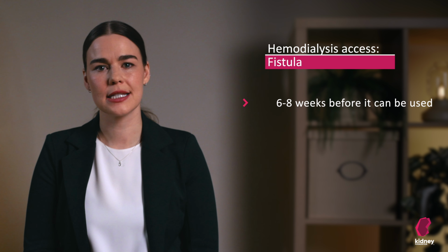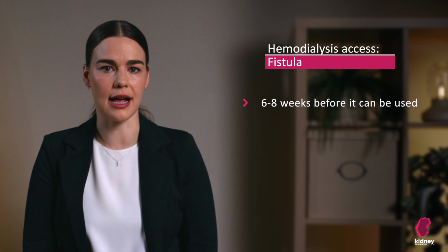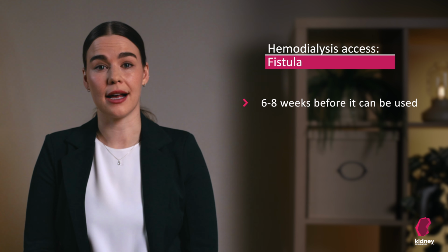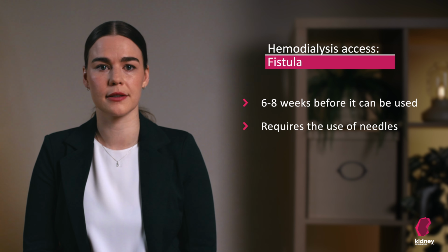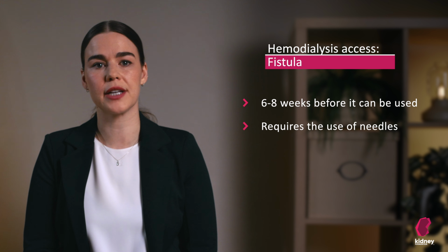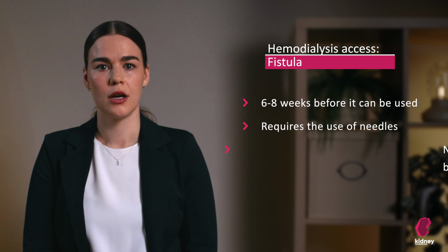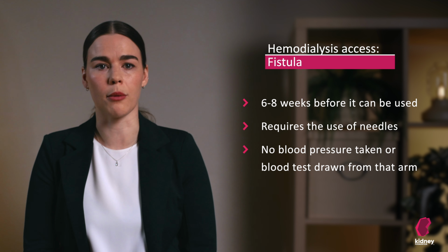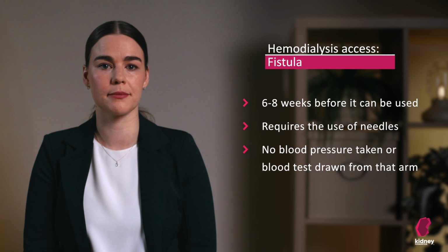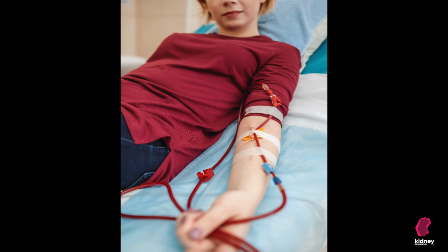You must wait 6 to 8 weeks after the fistula is created before it can be used for hemodialysis. At each dialysis session, a nurse will insert 2 needles in your arm to do the treatment. The needles will be removed at the end of the treatment. You should avoid having your blood pressure taken or your blood drawn from the arm where you have a fistula or a graft. Here is an example of a fistula.